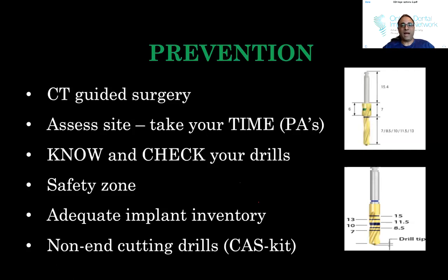You have to know the drills you're using. You're doing surgery. You need to know every single thing about that drill. How long is it? What's the Y factor? Everything. And then having adequate implant inventory. So don't tell me, oh, I placed this implant and hit the nerve because that's the length of implant I had. If you can go shorter, go shorter.